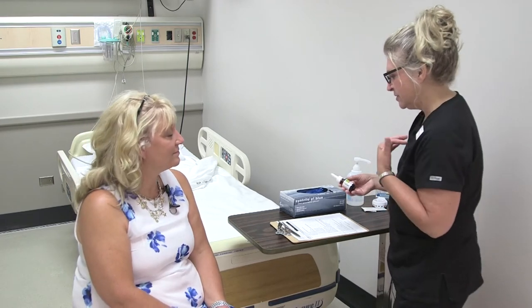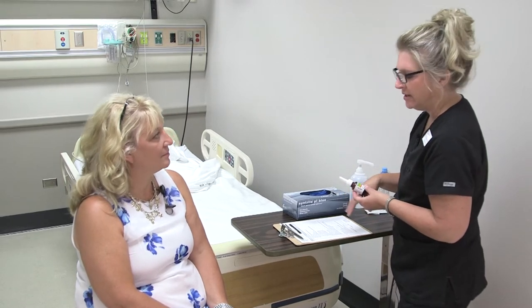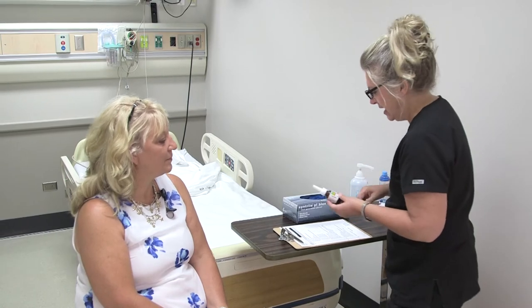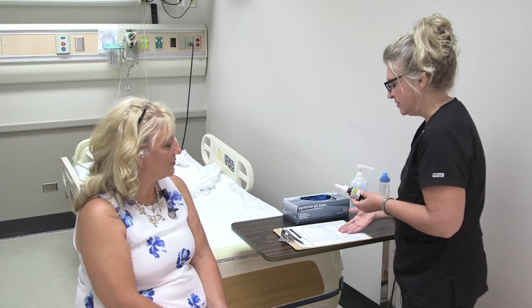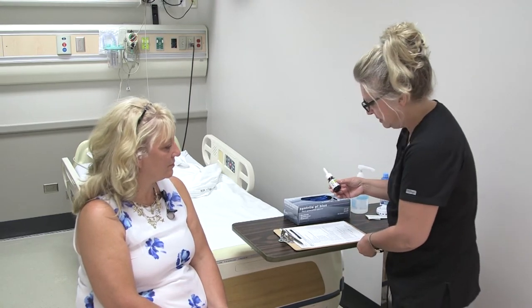I completed my first two checks at the Pyxis machine. This would be where I do my third check with the computer and scanner — checking against your chart and verifying the expiration date.